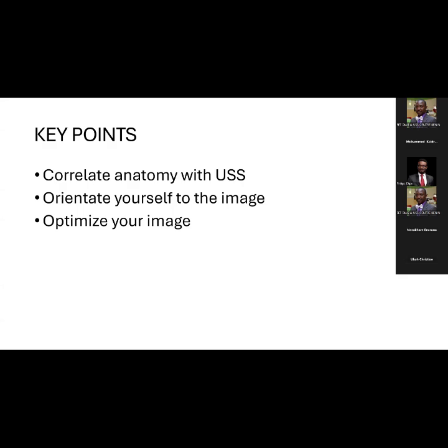You move it to the right, you see the right ovary. If it's not very clear, then you should turn to your coronal view. You will see it. You do the same thing for the left. Yeah, transvaginal, that's what I'm telling you now. For transvaginal, your probe should go to the side in a sagittal orientation. When you get there, if you don't see the ovary, then you turn to the coronal. It's best to do it this way because it gives you some orientation. The same thing should be done for the left side also.